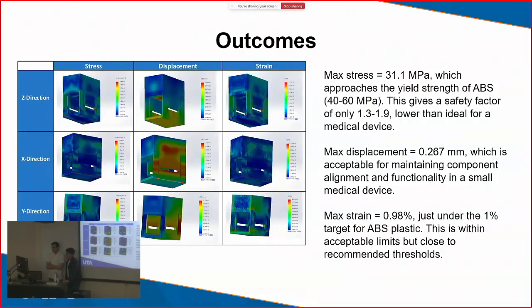Regarding our prototype, we just needed something to test with, so I didn't really add a spring device in this. This came out pretty abruptly. We just needed something to align the wavelengths and the detector within a certain distance of each other. Do you have a concept for a wearable device? Yes, we do have a concept, snug to the finger. All right. Good deal. Thank you.